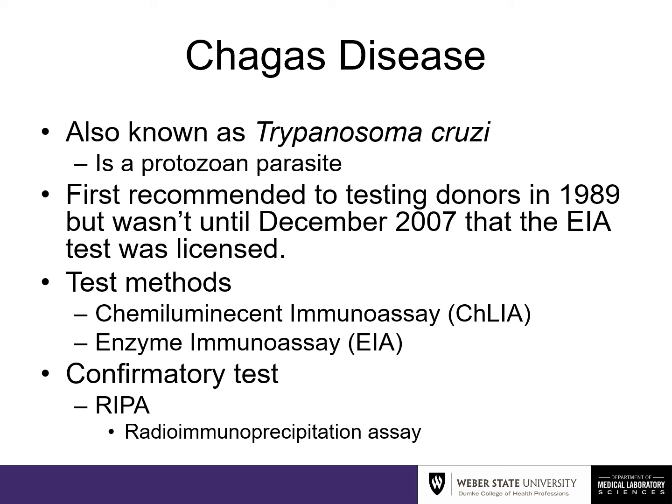There's also a confirmatory test, the RIPA test, or the radioimmunoprecipitation assay.